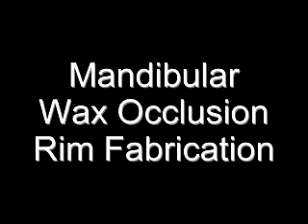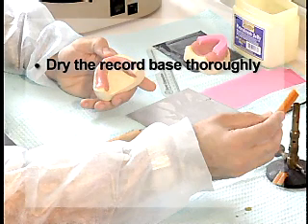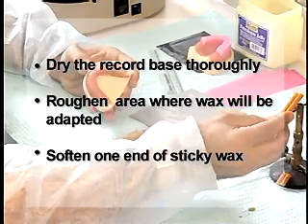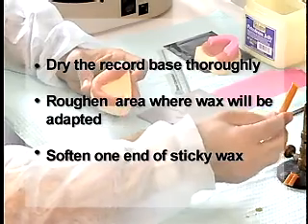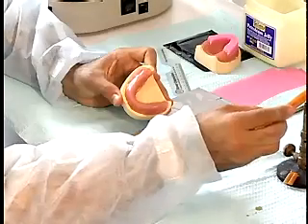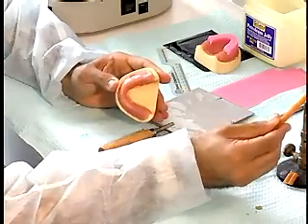The procedure for making the mandibular rim is very similar to that of the maxillary rim. Dry the record base thoroughly, as wax will not adhere to a wet surface. Roughen the area of the record base where the wax will be adapted. Soften one end of the sticky wax slowly over a Bunsen burner flame and place the sticky wax over the ridge crest area of the record base.